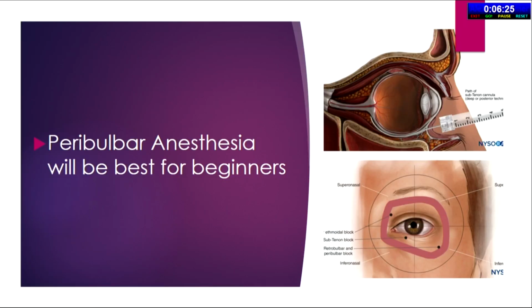So which anesthesia is best for SICS? Because from Phaco, when you are migrating to SICS, this will be the most trickiest part. You are habituated in doing topical and suddenly your patient's eyes are moving, you are not able to make the tunnel. So which is best?